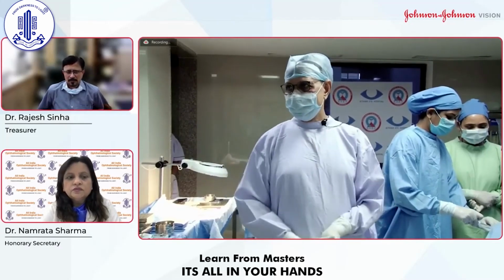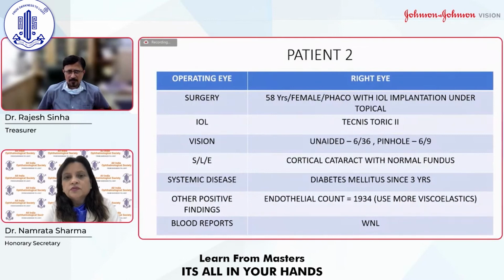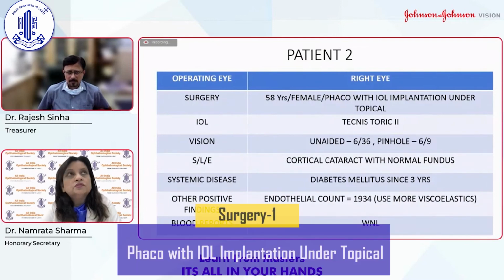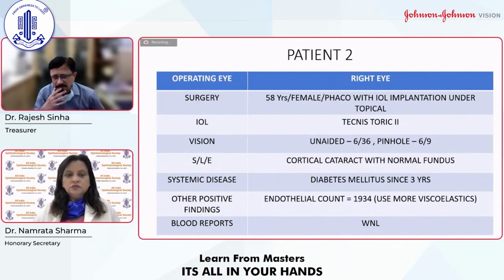That we can get our values also. Okay. Thank you. So we are proceeding for the next case, a female 58-year-old. We are planning for Phaco with an implantation and topical. Here again it is a toric 2 and it's a cortical, normal fundus. Diabetes under control. And here there is a positive finding.